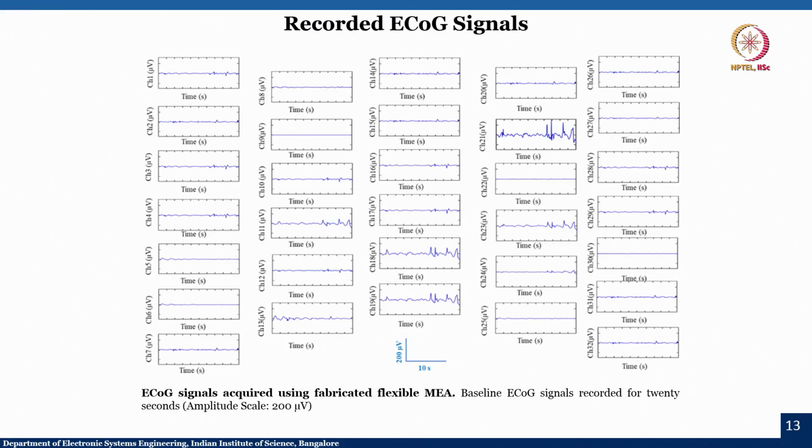So, like I said, we need to understand what happens when we measure these ECoG signals from the brain. When you are going to measure the ECoG signals from the brain, then you will have the baseline.